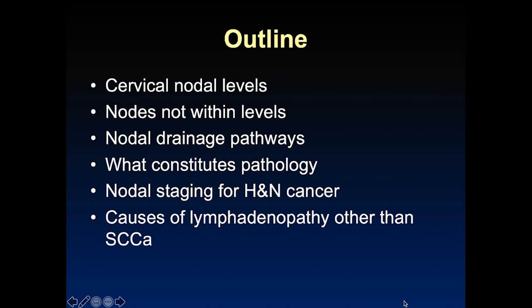And we're going to go over classic nodal drainage pathways from various aerodigestive tract subsites so that if you see a cancer in one of those subsites, then you can look in those nodal levels in order to identify any potential nodal metastasis.